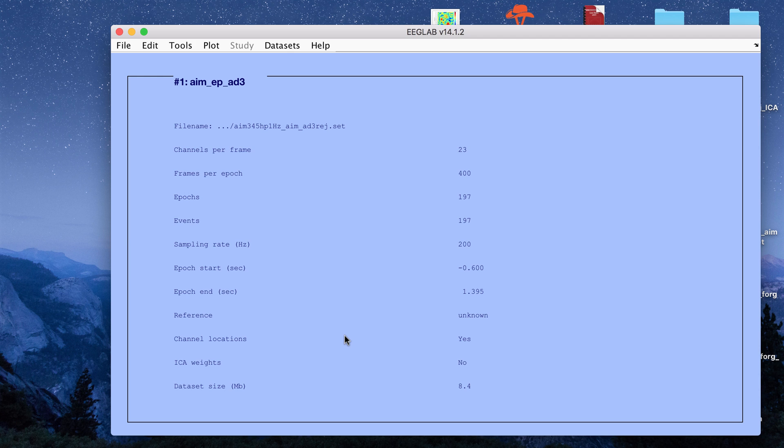Hey guys, in this video I'm going to go over how you can do artifact removal using independent component analysis for EEG data. I'm going to be running ICA in EEGLAB.